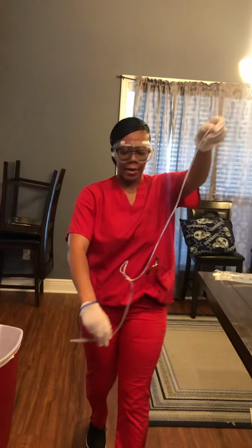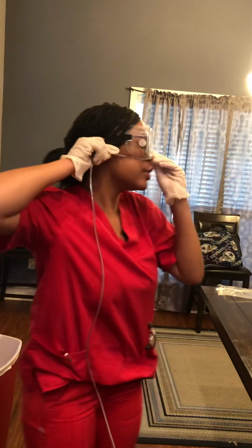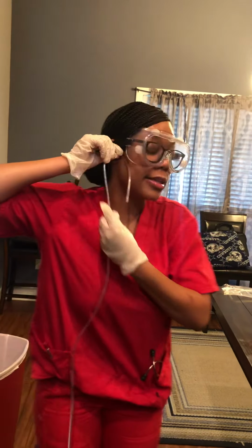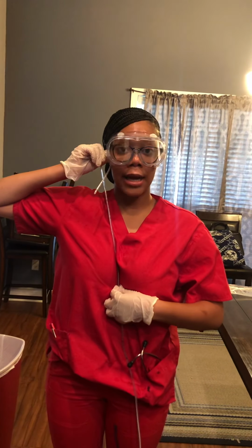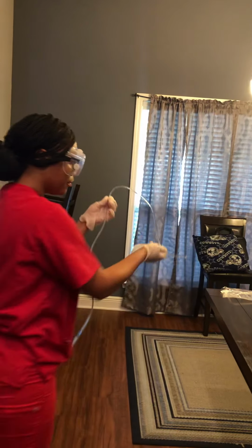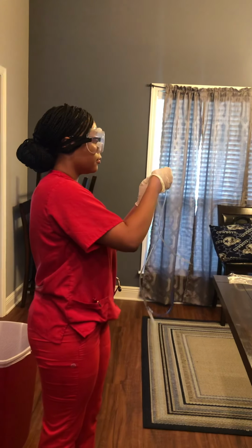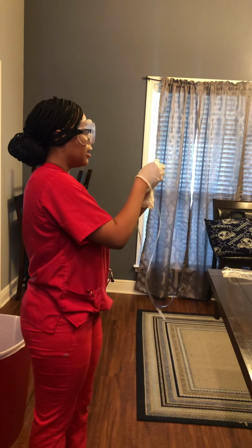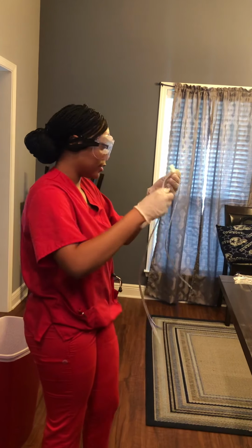I will first measure my nasogastric tube, going from my patient's nose to the earlobe, and then down to the xiphoid process. I will note that in a normal hospital setting, I would not do this over my patient's clothes. With my measurement secured, I will then use my dog ear piece of tape to hold my measurement, and I'm using this because it will be easy to remove during the insertion.